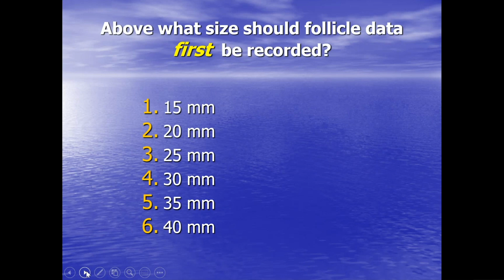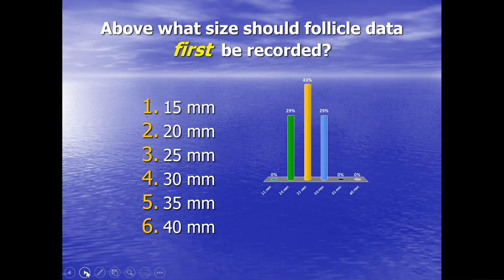When do you think you should first record the follicle size? Well, there isn't really a right or wrong answer. If any of you are struggling to think, oh, I don't want to say anything, I want to get the answer right, let me reassure you, there isn't a right or wrong answer. Let's have a look then at what people voted for when I was here.